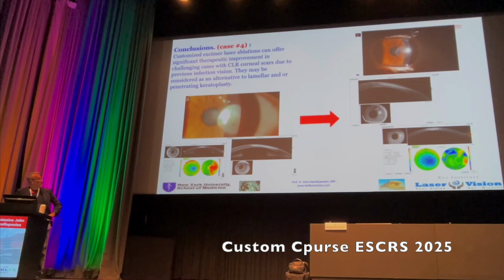Another thing that reduces cornea scarring clinically is the fact that in these scars, the stromal part of the cornea is very irregular. See how indented this line is here that separates stroma from epithelium? That's why the epithelium is so variable and thick. It's trying to smoothen out this irregularity. Once you do the laser, this edge of the stroma becomes much smoother, and it's my impression that this also has something to do with how keratocytes lay collagen and how further scarring evolves. So just smoothing the surface will help that cornea become less scarred.